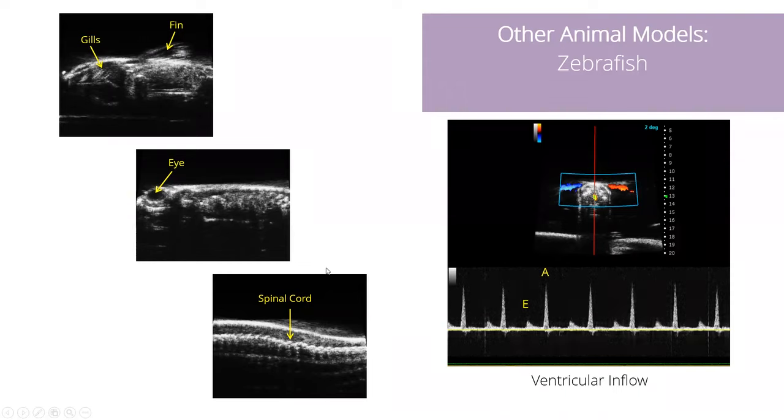So some groups doing resection of part of the ventricle can begin to look at returning flow and function of the heart, both in B mode, color Doppler, as well as using pulse wave velocity to measure and quantify that.